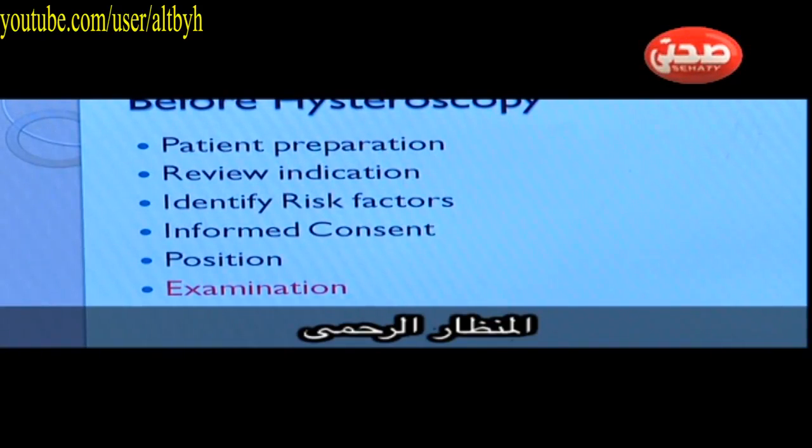Also, it's very important to inform the patient and to take an informed consent, and to explain the benefit of the procedure in detail, and also to make sure that you explain the complications of the hysteroscopy, mainly the risk of perforation and the risk of pain and bleeding.